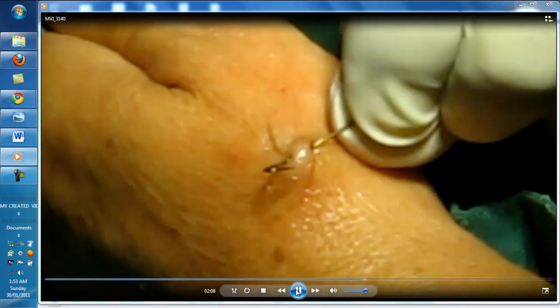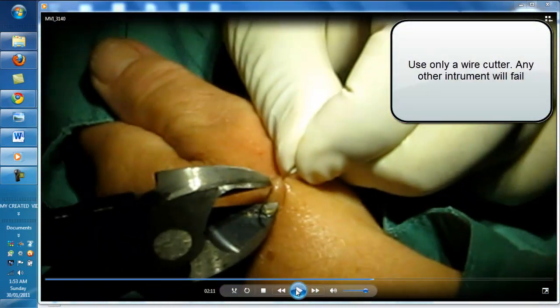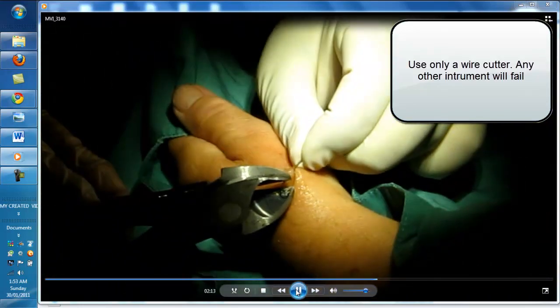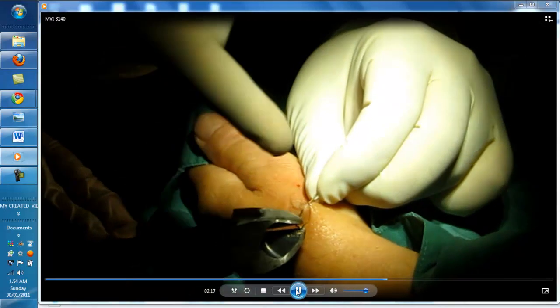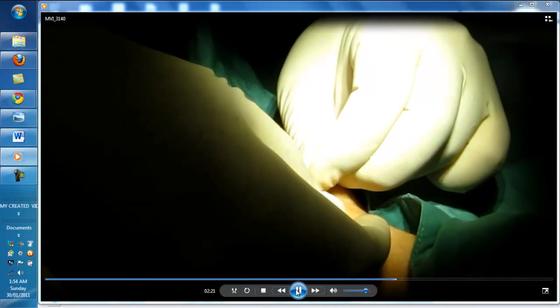You just cut it off from the tip. Yeah, just because it's going to shoot when you cut it — it's going to snap away — so I'm going to keep this. Yeah, all the way. Thank you.